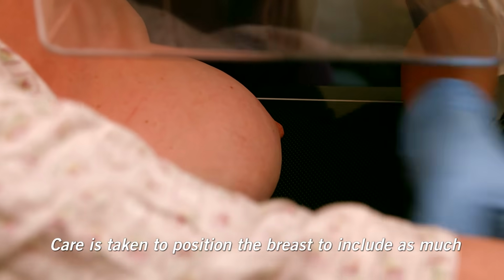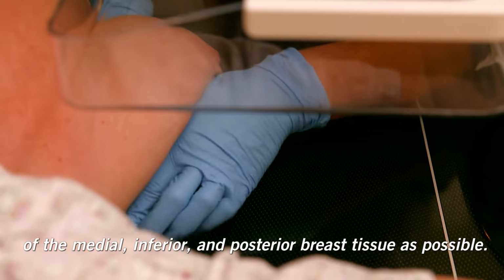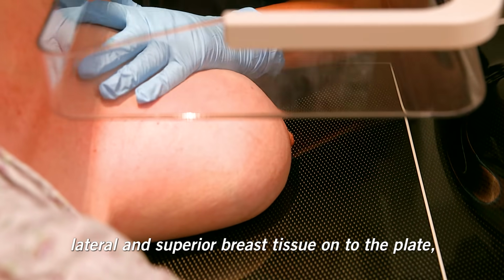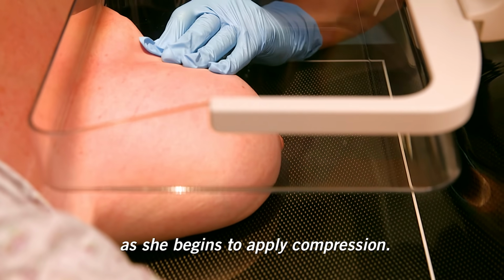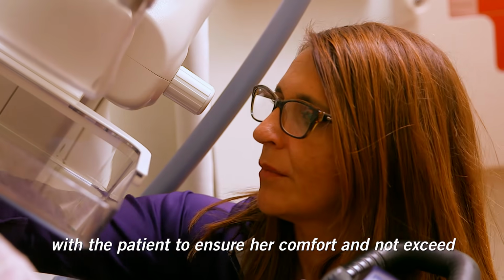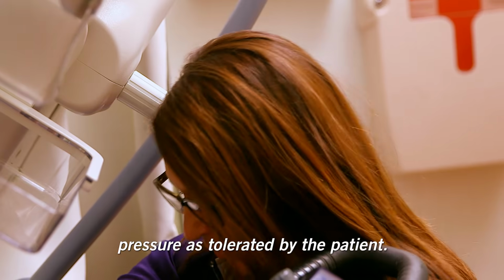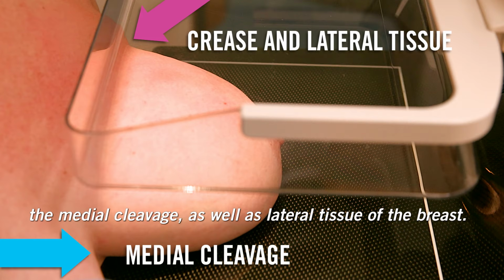Care is taken to position the breast to include as much of the medial, inferior, and posterior breast tissue as possible. The technologist then uses her hand to bring additional lateral and superior breast tissue onto the plate as she begins to apply compression. While applying compression, the technologist communicates with the patient to ensure her comfort and not exceed pressure as tolerated by the patient. Here, the breast is optimally positioned with inclusion of the medial cleavage as well as lateral tissue of the breast.